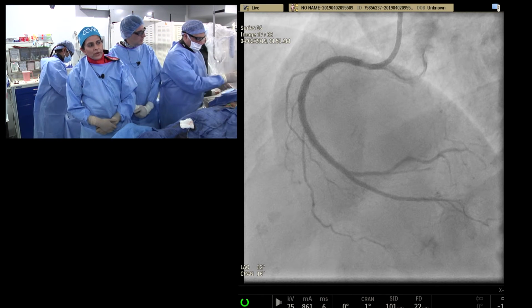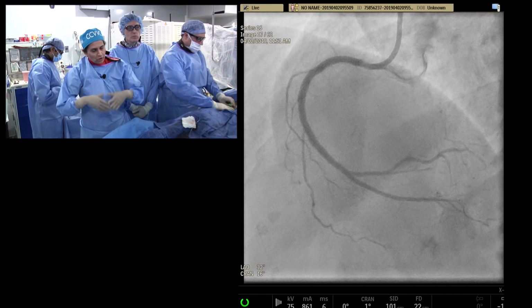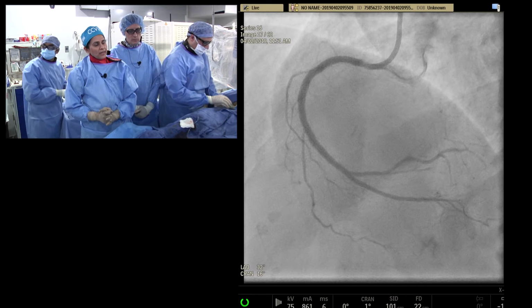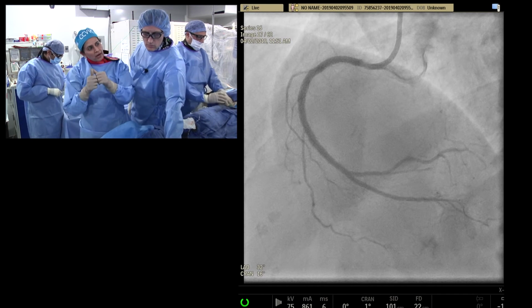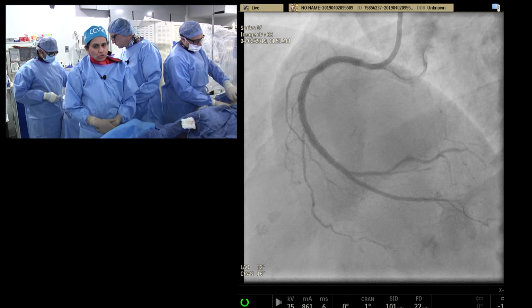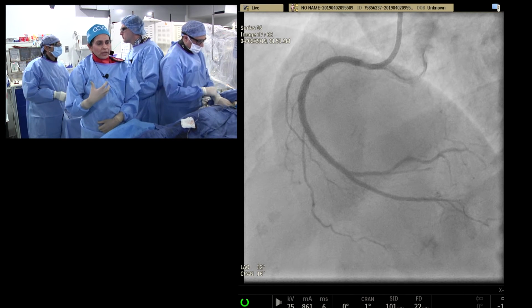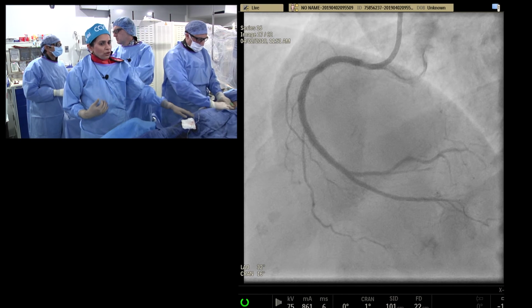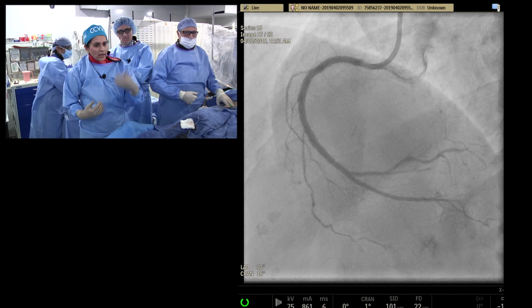Very interesting question. Once we are doing all this work, you see that since the blood flow is going down antegrade, most often when we are doing anything with the calcium, you see problems in the distal bed, not usually retrograde where it flies up to the brain. When could it likely fly to the brain? If you have a lot of atheromatous debris in the aorta, and when we are going with the catheters across the aortic arch, that's the time that anything in the aortic arch may fly up to the brain.